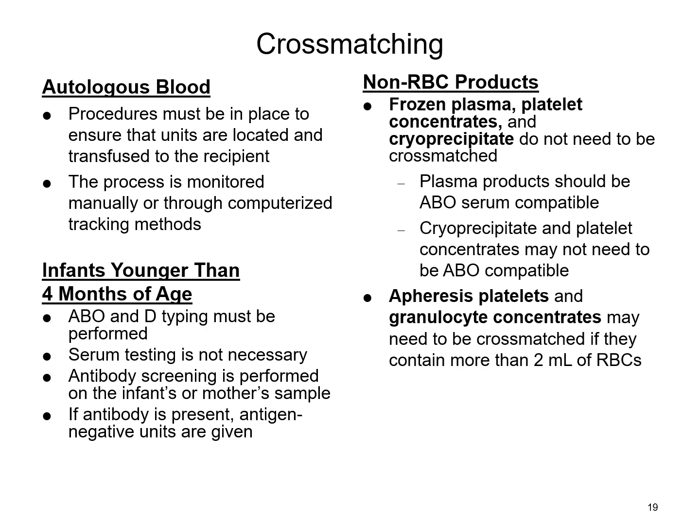Now, if you have an infant younger than 4 months of age, of course, you're going to do the ABO and RH. Serum testing is not necessary, and this is because, as you recall, babies have mom's antibodies for those first few months of life. So really what you should do is do an antibody screen on mom. And again, I just want to make note here that if you run into a scenario like this, you are requesting the sample be collected from the birth mother.